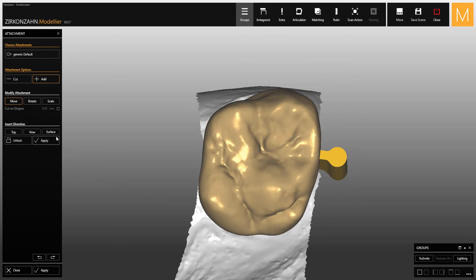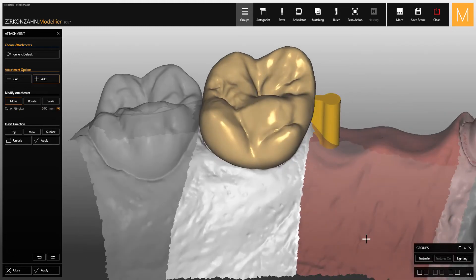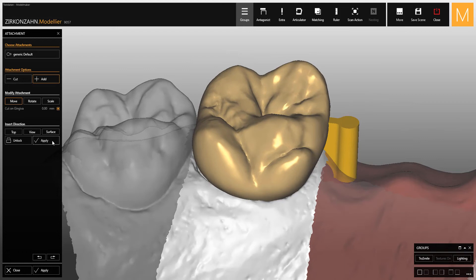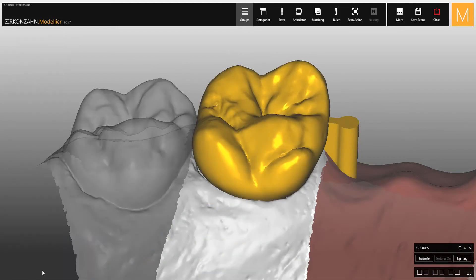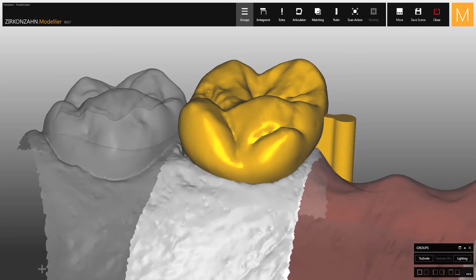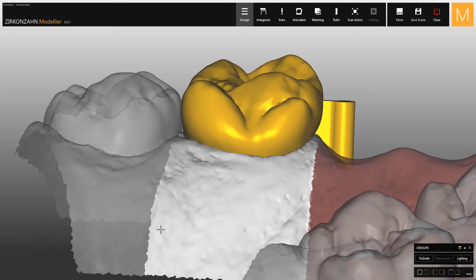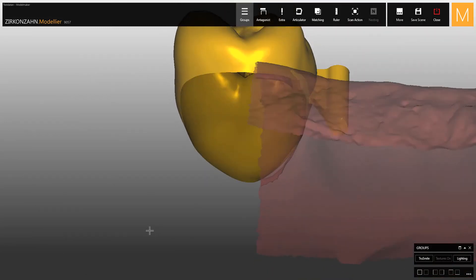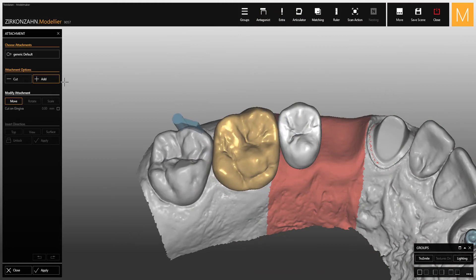In order to adapt the attachment to the gingiva scan, activate the cut on gingiva function and click apply to merge it with the structure. To cut out an attachment from the structure, activate the cut function in the wizard.